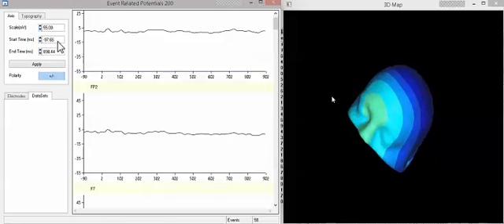One can also look at different electrode arrays by clicking here and select as many electrodes as you wish. We can go up to 128 electrodes and certainly the 10-20 system.